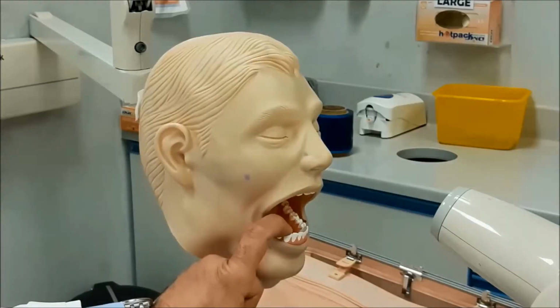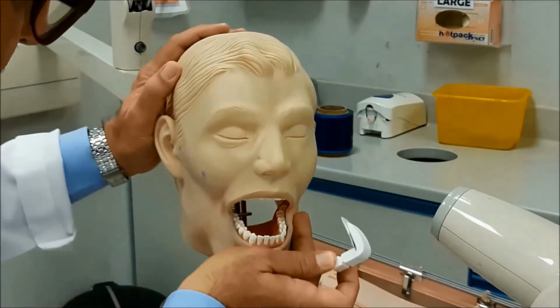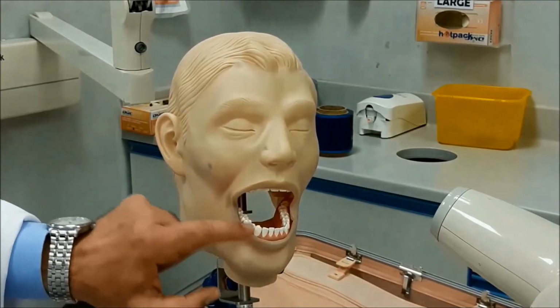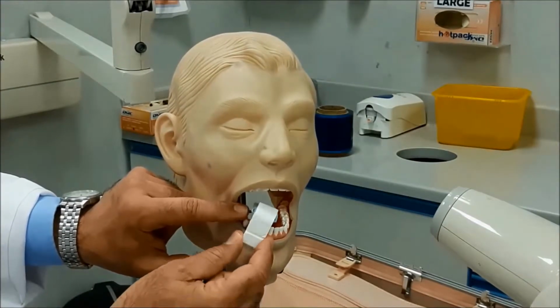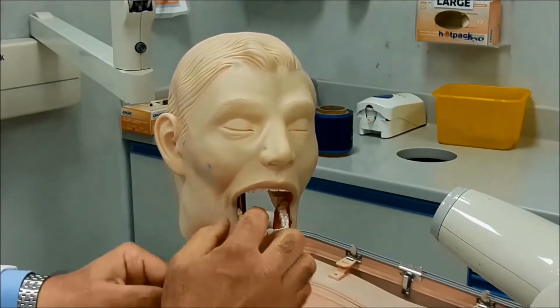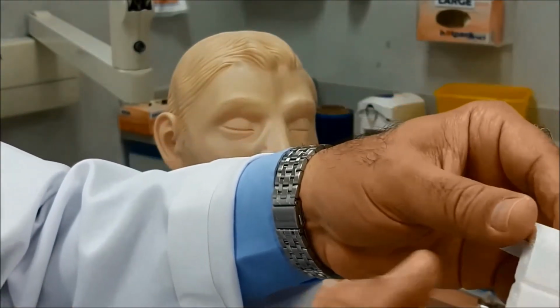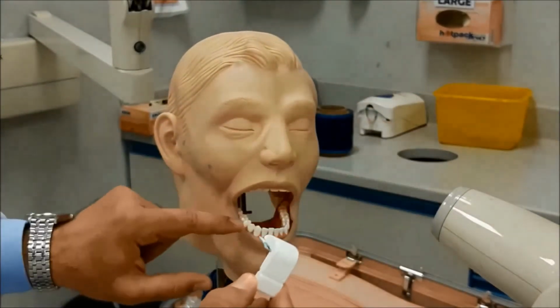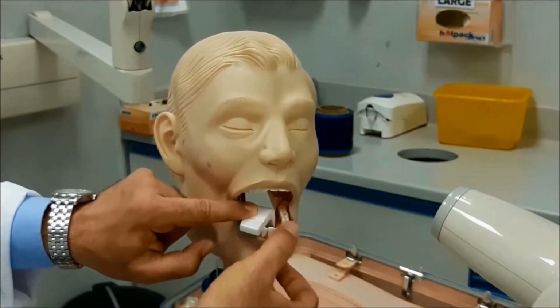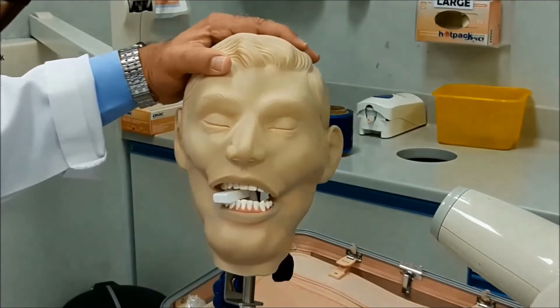of the image. If you want the canine, then which tooth will be in question? In this case, the canine. You will place your sensor behind the canine, exactly. Ask the patient to bite on this slot. Okay. This is used for the patient. You use it for the patient to bite. Okay. So canine, and then ask the patient to bite. Okay. And this is how it looks from the side.